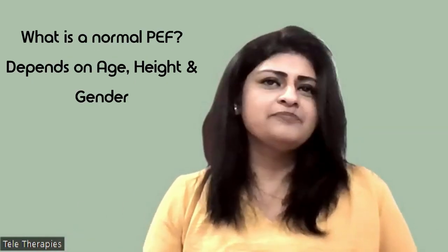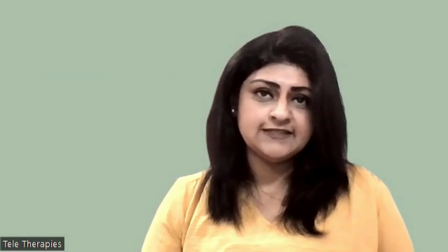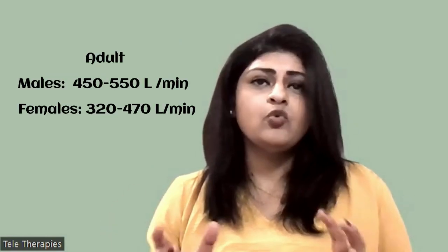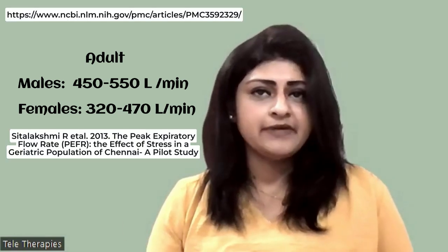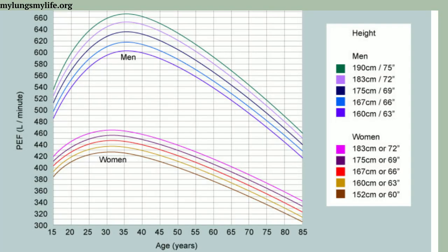Now, the question is: what is a normal peak flow? It depends on the age, height, and gender of the person. Normal peak flow varies between 450 to 550 litres per minute in adult males, and 320 to 470 litres per minute in females. The chart on the screen shows how peak flow measurement varies between genders depending on age and height. As you can see, peak expiratory flow is highest in both genders between ages 35 to 40, and then you can see a gradual decline in the peak flow rate measurements.